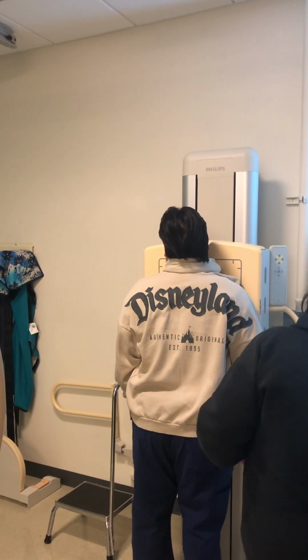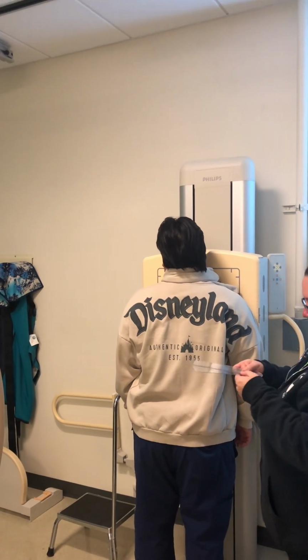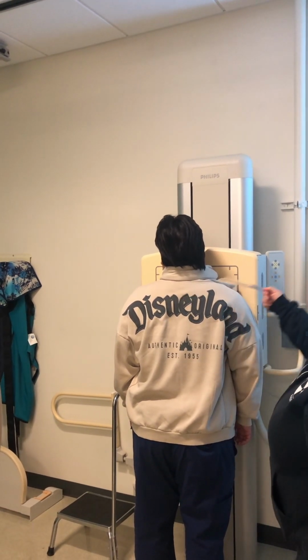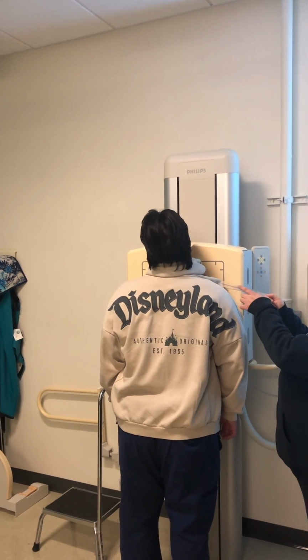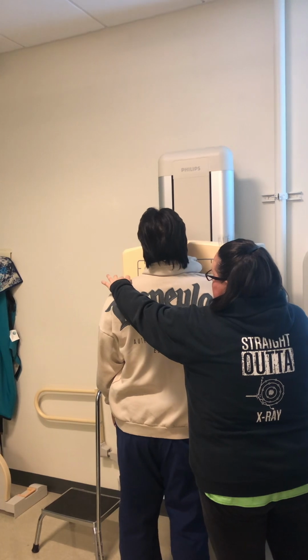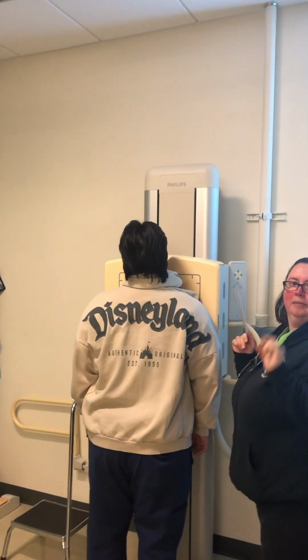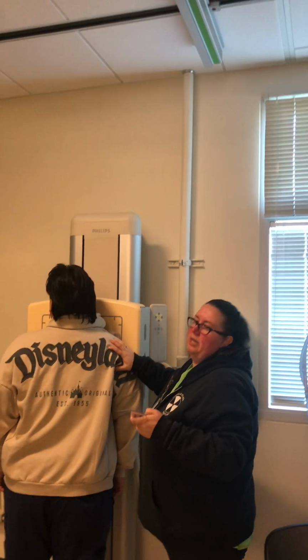But, okay. Again, remember that 15 degrees is very slight. Okay? So it's kind of hard to tell, but I'm thinking of this as the shoulders, and so I'm only adjusting them a smidge. If you try to actually sink their shoulder all the way to the board, you will have rotated them too far.